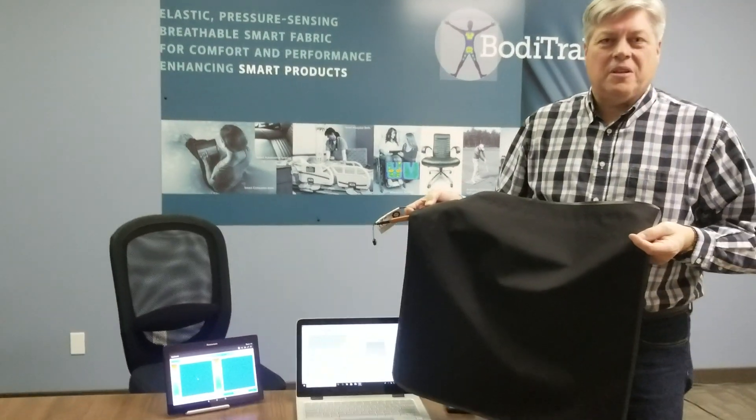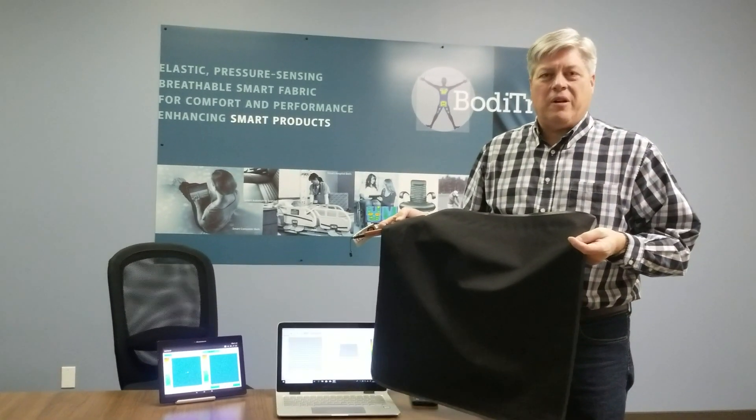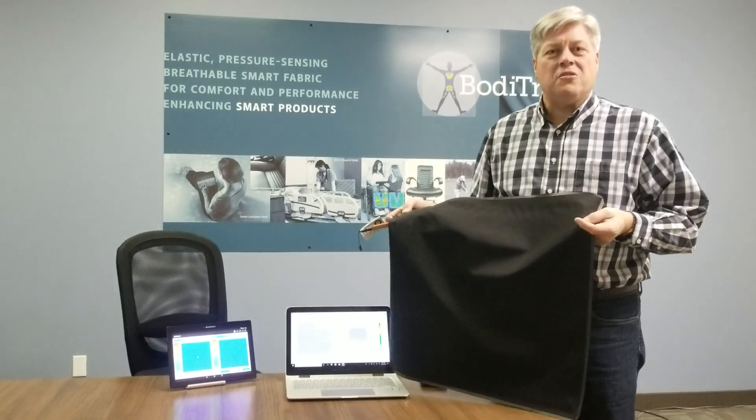Good morning. I'm here to do a quick orientation on BodyTrack 2 — in this particular case, a seat mat.